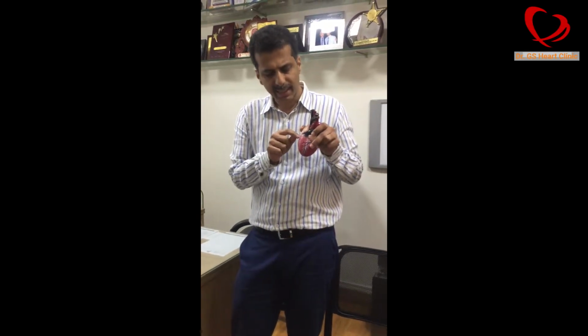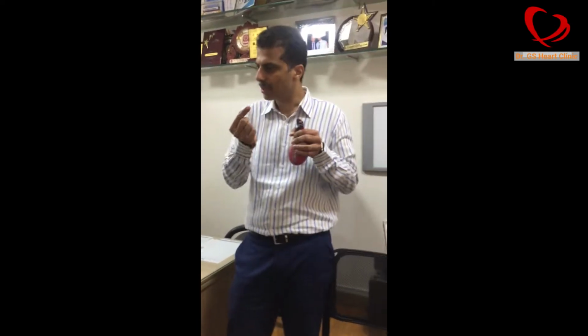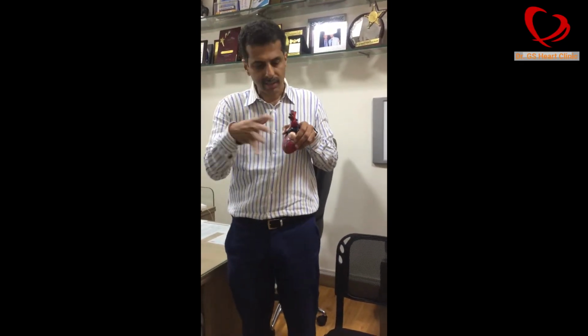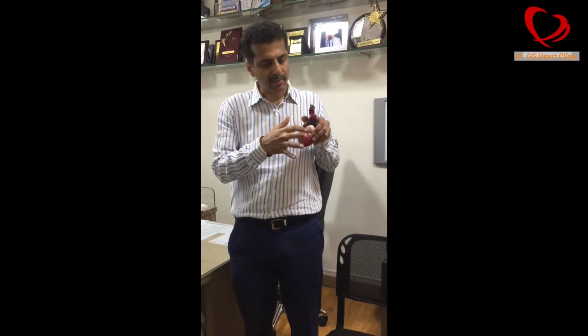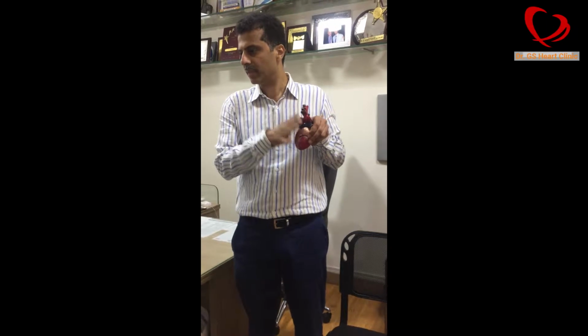Sometimes, particularly when the artery divides into two branches, because of the angulation, we have a chance of missing a block in the beginning of the bifurcation where it divides. Yes, because we have to take X-rays in different angles. So this is a two-dimensional imaging angiogram. We have done the angiogram. In the angiogram, in the left main LAD area, that block was not clearly seen.